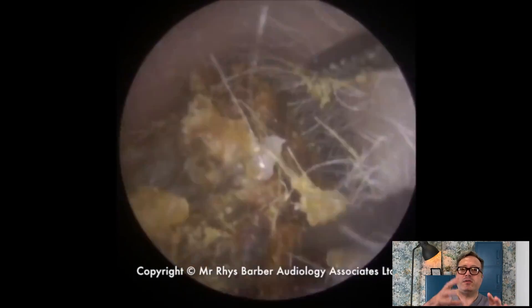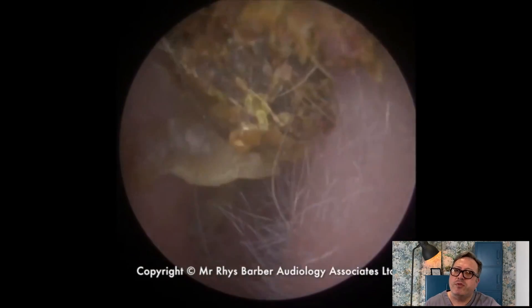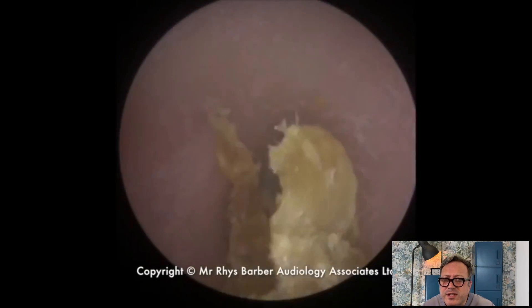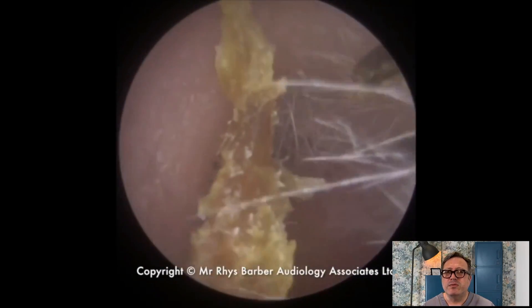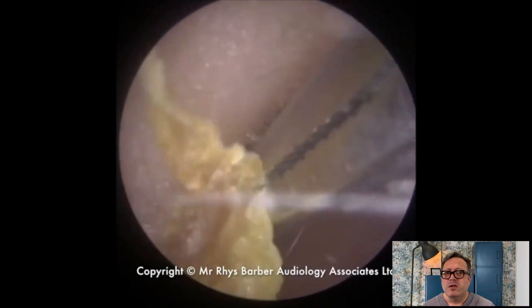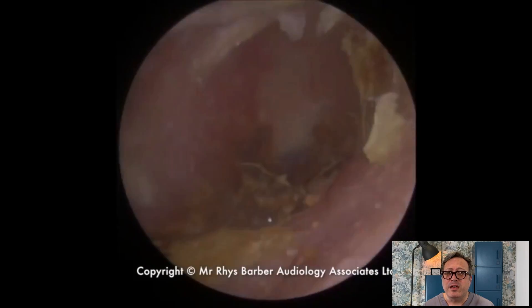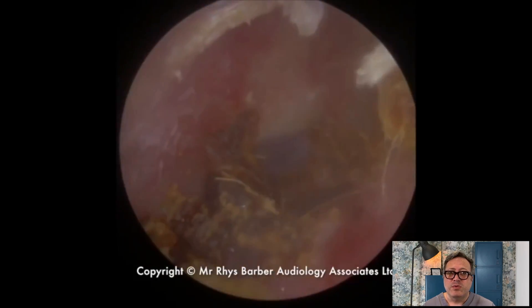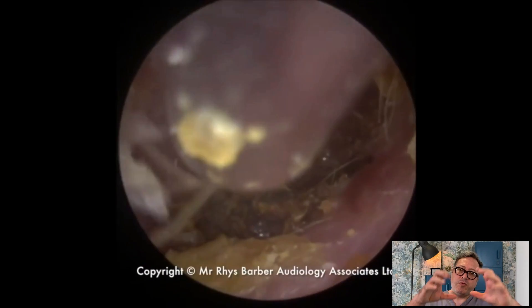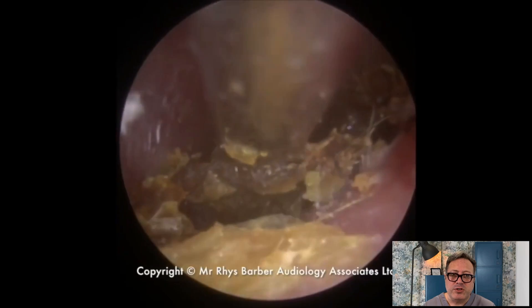That's really, really dry. With the benefit of hindsight I think I would have gone in with a Jobson horn at this point and tried to pull forwards. It's still attached — look at all that dry skin coming away, my goodness. Okay, so we should be able to get a grip on this section now — wow, look at that coming away, and there's still more in there. We can see the top of the eardrum there. I forgot how good this was. We're going to lift this bottom section now.